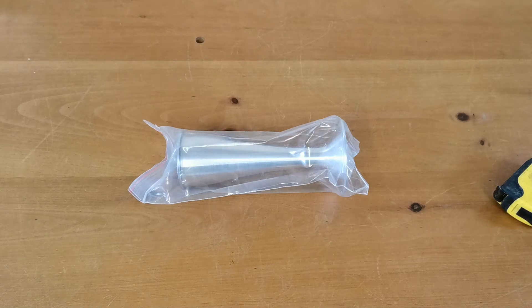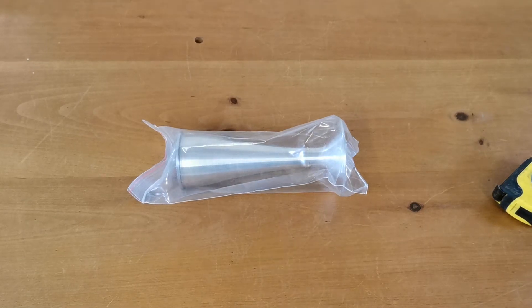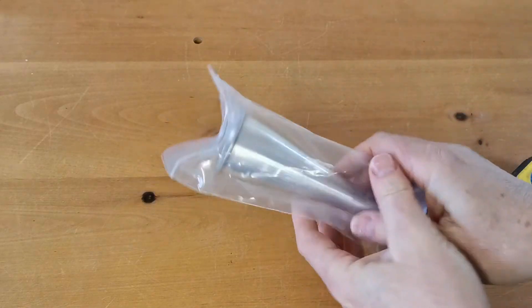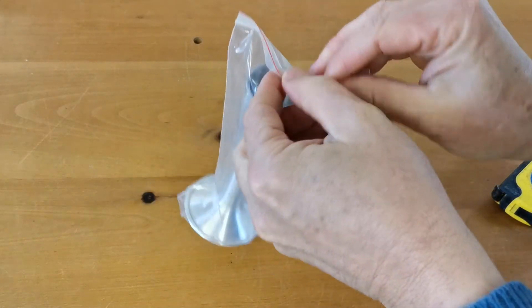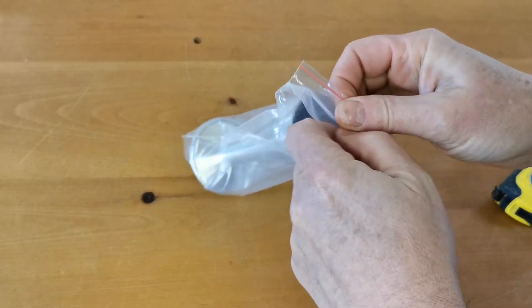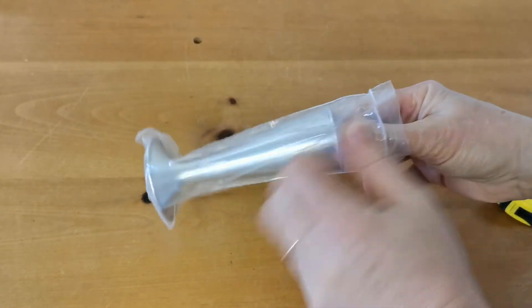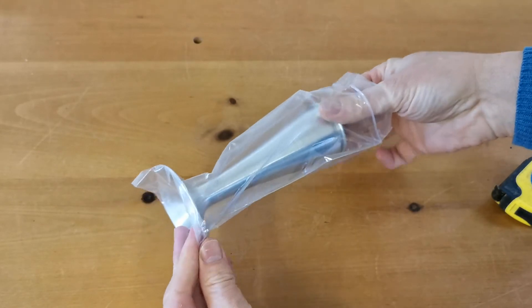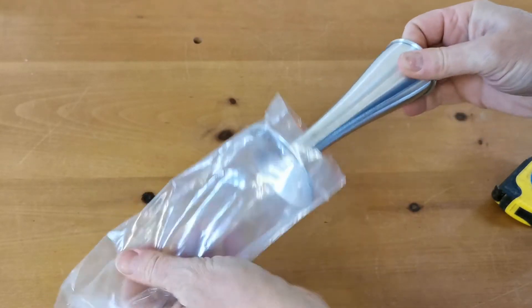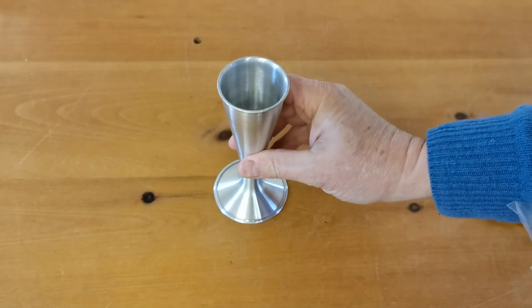Welcome to this product support demonstration video. This is the new aluminium pinard foetal stethoscope that we've sourced for sale on the Valumed website. It replaces the older units that we have. We've got two pinards available currently: one is a cast metal unit and the other is a pinard tube stethoscope with earpieces.